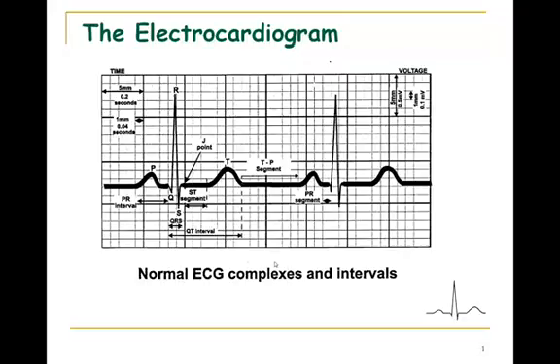When we look at an EKG, otherwise remember it is also called an ECG, what you're looking at is not single action potentials. What you're seeing is multiple action potentials that are taking place in the heart at any given time, recorded from the surface of the body. Remember, the electrodes are the adhesive pads with conductive gel that are attached to your skin. The electrodes are then hooked to the monitor or the EKG machine by wires, which we refer to as leads. When you record the EKG, what you're seeing is summed electrical activity.